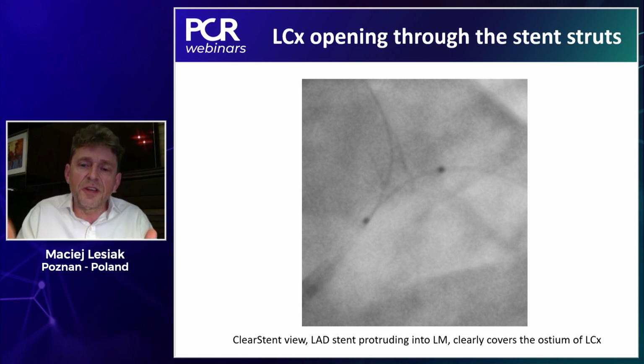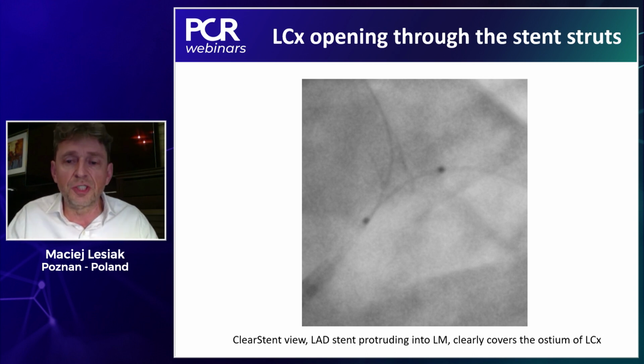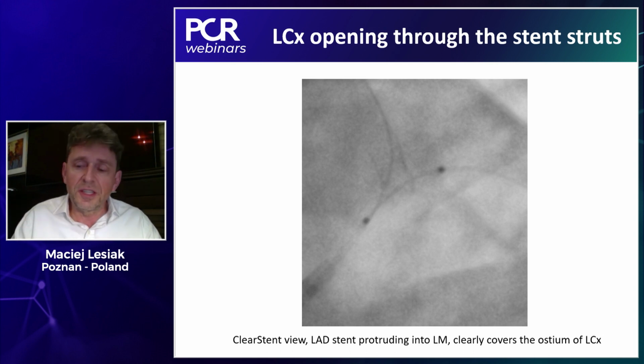If it were a very early stage, say days after the procedure, we may have a huge problem with wiring this, because you may get your wire under the struts of the stent, even towards the LAD. Fortunately, it's 9 months later, so everything was healed.